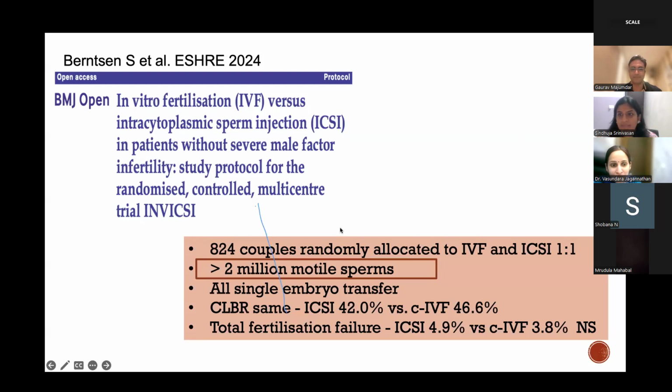So, sir, meanwhile, can I ask a couple of questions while people are answering? Yeah, please. Okay. So, sir, you said in your study, it was a sibling OCC study, I understand. Yeah. So was there a criteria, like you randomly selected the OCCs and split them, or did you select the mature OCCs, whichever looked mature, for IVF? No, absolutely random. Okay. And the minimum sperm quality, like you mentioned, I think even in your study you used the 8 to 10 million post-wash. Yes. Okay. And was it a well culture or a droplet culture?